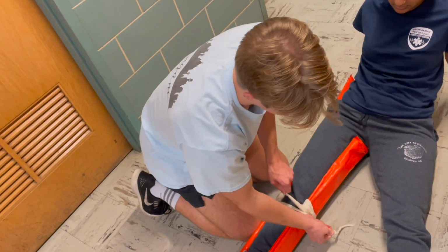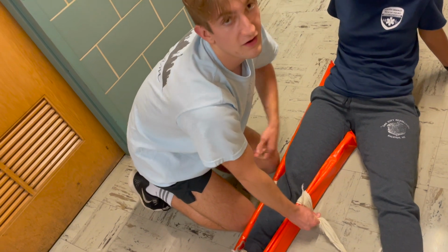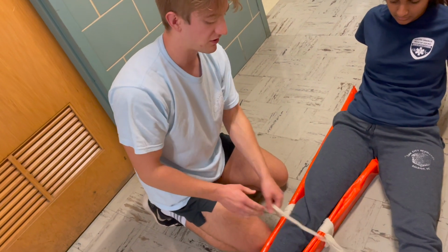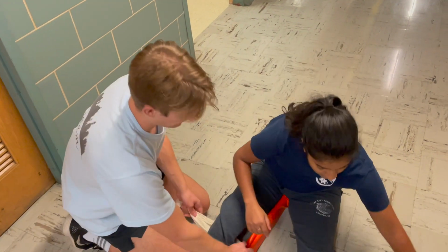We tie knots always on the board so that we can hold them really tight and not have a knot on the patient's skin, which can be painful or uncomfortable. I'm going to undo this and finish the splinting in the way that you're expected to do it. It's a little simpler.